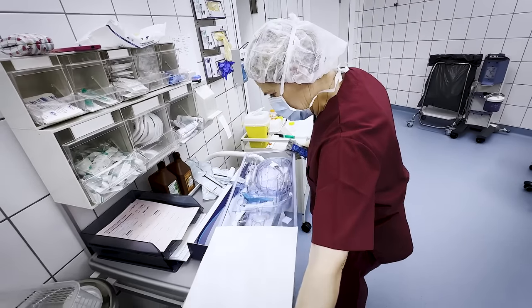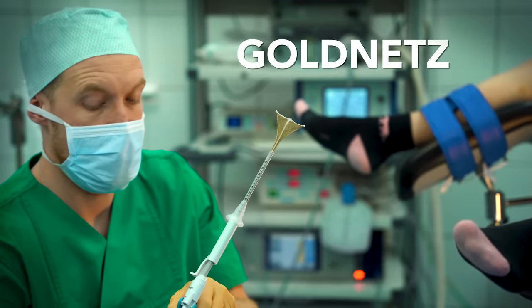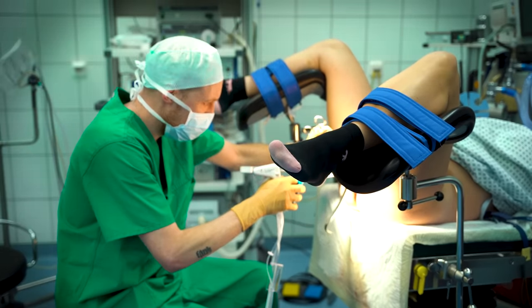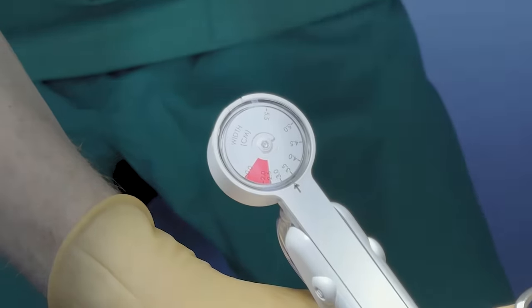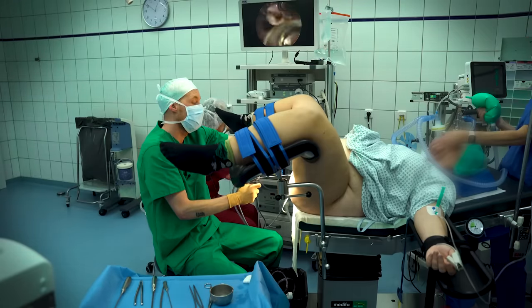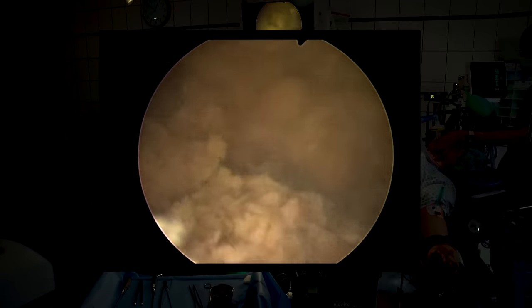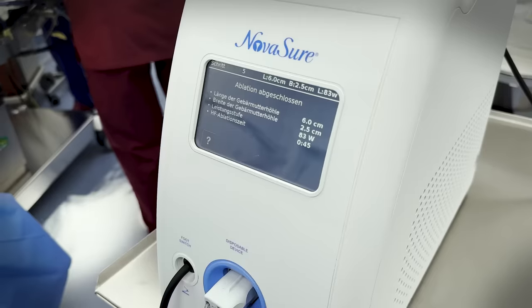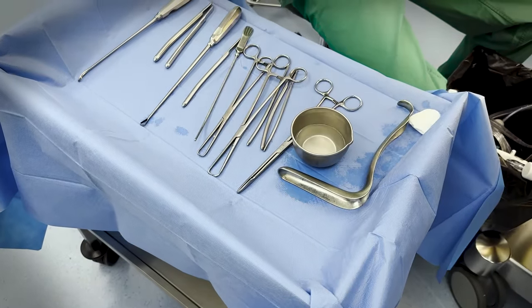Then the Goldnets instrument is unpacked. It's a single-use product — you only use it once. At the front, which is why it has the name, is a small gold net which unfolds and adapts to the uterus. The device is set according to the measurements, then inserted. Once unfolded in the uterine cavity, it also measures the width automatically. All data is entered, the pedal is pressed, and the ablation begins. It runs automatically, so I don't do much more. When I remove the instrument, I check with the camera again to see if everything has really been ablated. The result looks like this: you only see oxidized mucosa, and the tissue remnants are all flushed out with the uterine fluid. The device then shows the final data, a medical tampon is inserted to absorb the uterine fluid, and that's it.